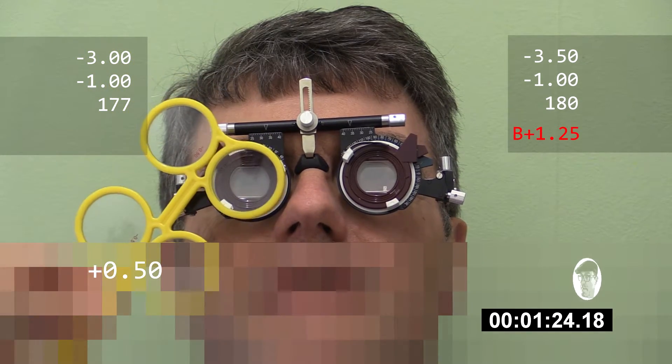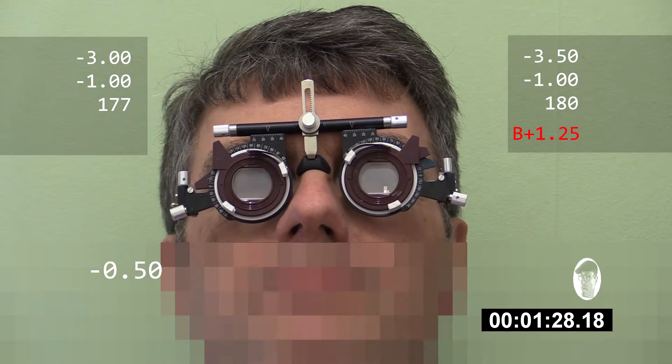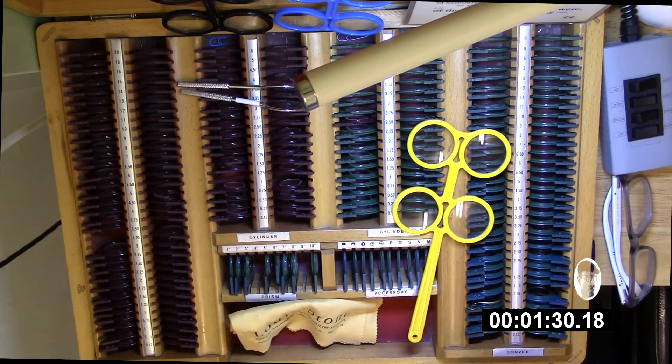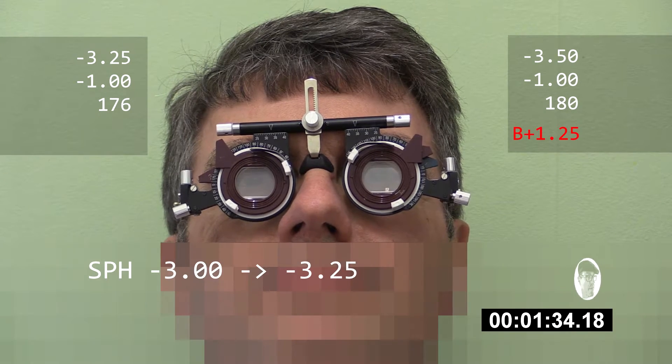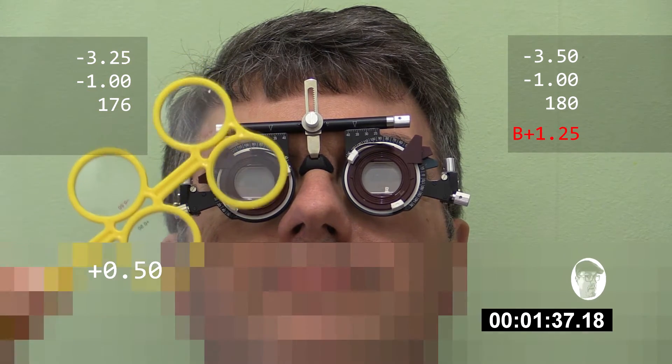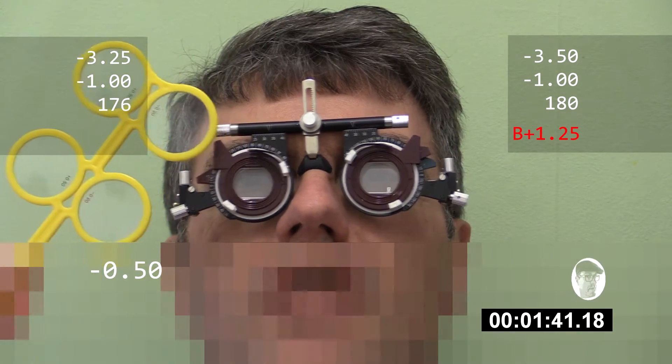Is it any clearer with? No, that's worse. Without? And clearer with? Yeah. That's good. Okay. There we go. And clearer with, without, with, or without.